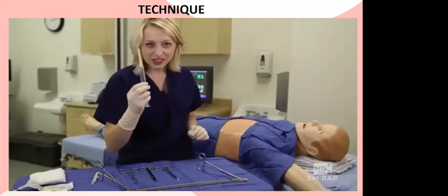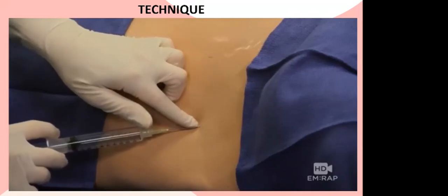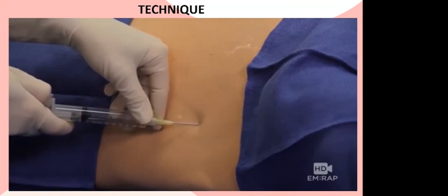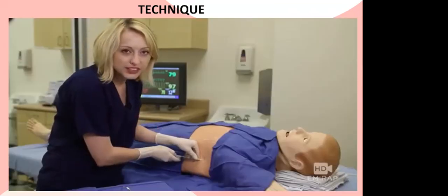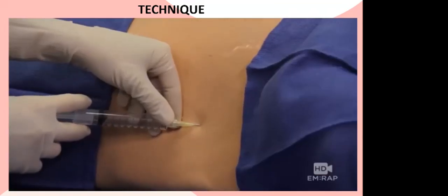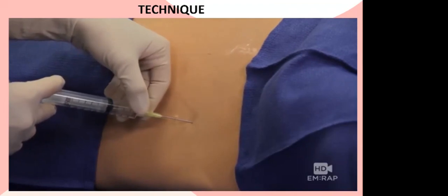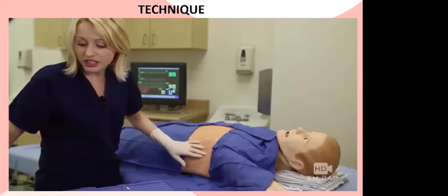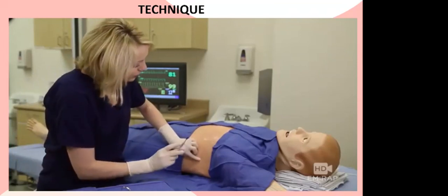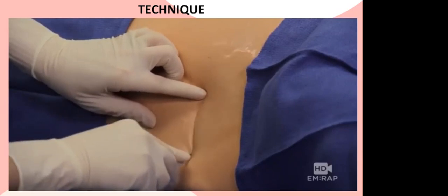Now, let's anesthetize the skin. Make a wheel at the skin, and then you're going to aspirate as you insert the needle. You'll know when you get in the pleural space because you'll get a gush of air or fluid back in the syringe. Then you're going to inject liberally as you withdraw the needle. Give that a minute to take effect, and then you're going to make your skin incision. So take your 10 blade and make a nice long skin incision.